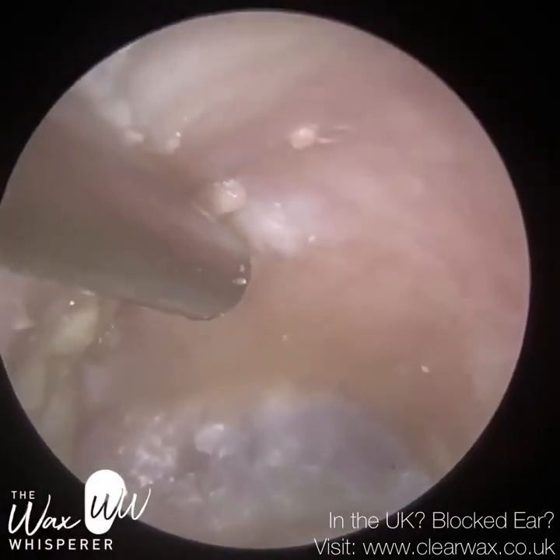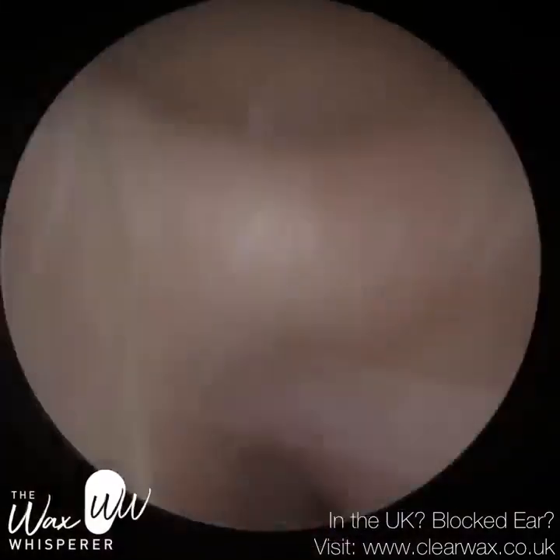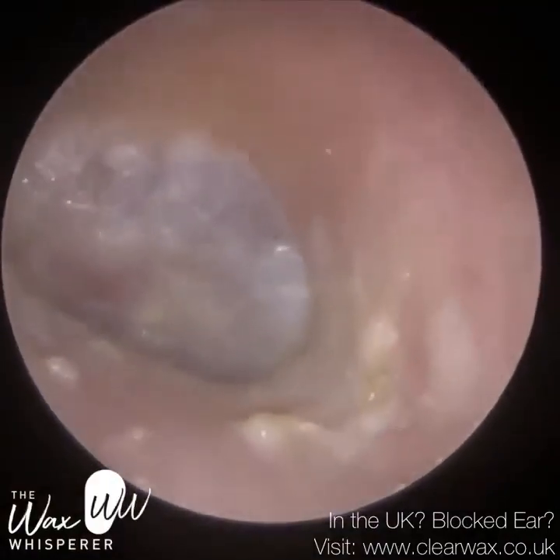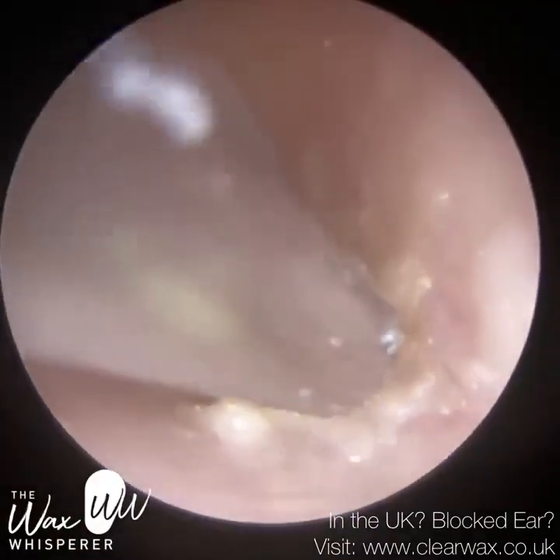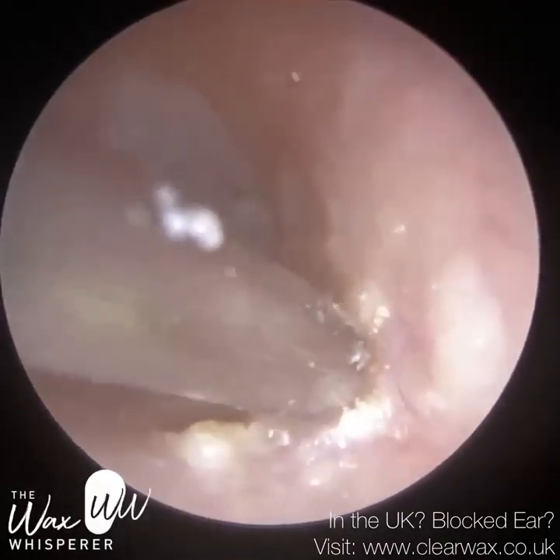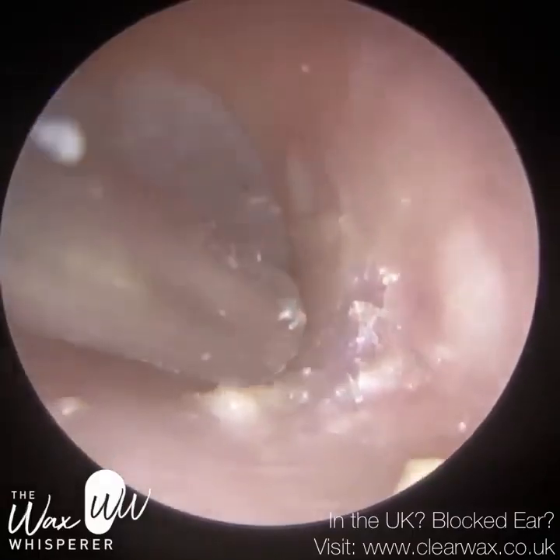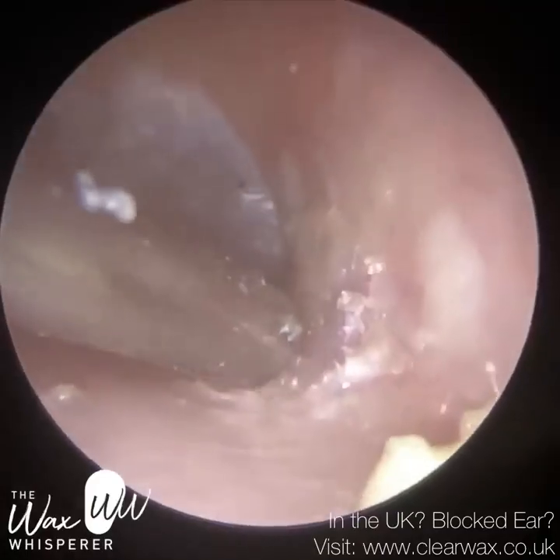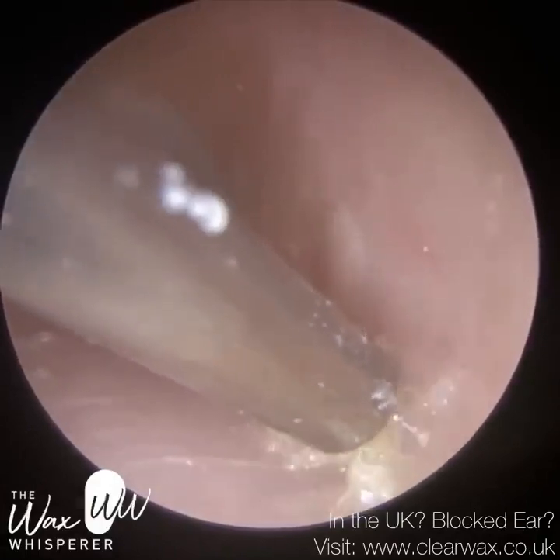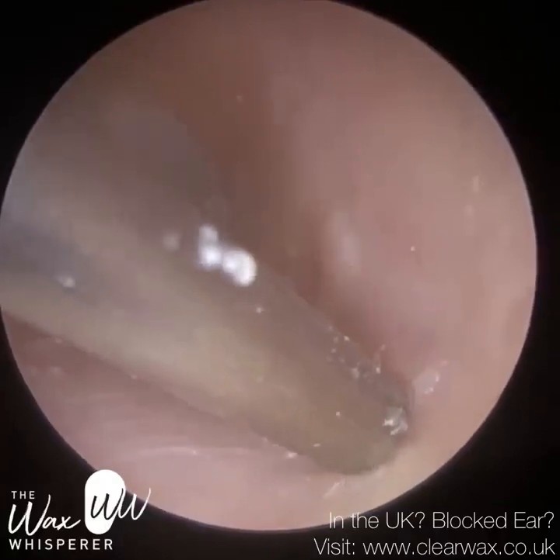It's like a little opening, a cavity, a widening adjacent to the eardrum in the front section of the ear canal. And quite often you can get debris there. With a microscope or an otoscope, commonly you won't be able to visualize inside the anterior recess. So if there is debris there, you're none the wiser. With an endoscope, however, you can see everything. If you hold the endoscope correctly and you get it at the right angle, you can actually visualize inside the anterior recess. So you will see me going back in there. There's a bit of debris there, and it's unbeknown to me at the moment.